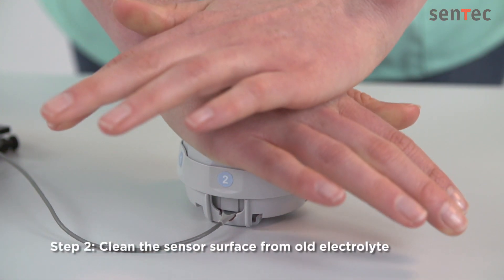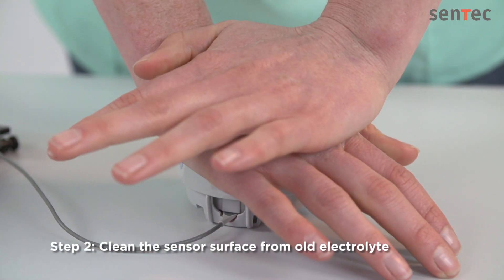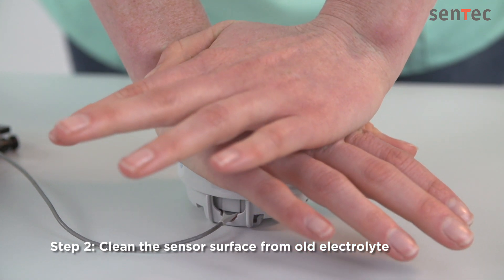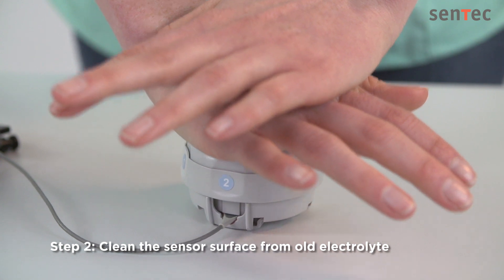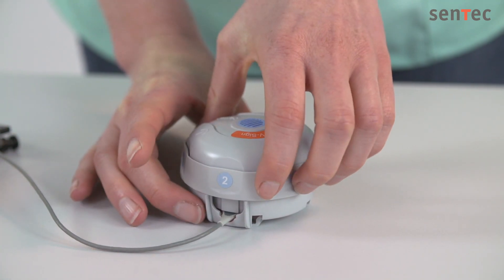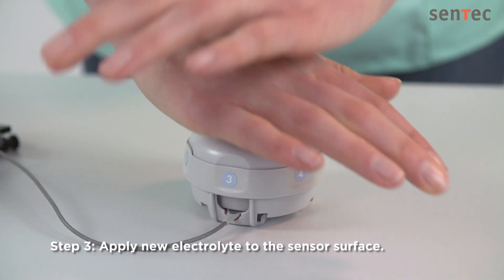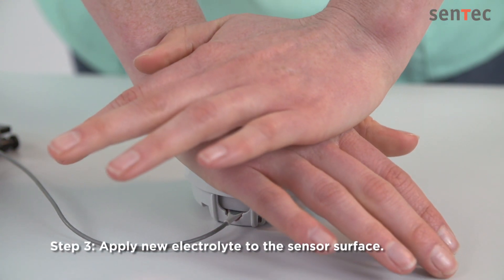Repeat this process in Step 2: press slowly but firmly, gently release the top, and then turn to the next step. And again in Step 3 to release the electrolyte, which is signaled by a pop sound.